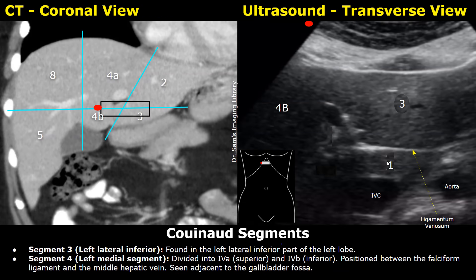This is a coronal CT image showing the interior aspect of the liver. Segments 2 and 3 are in the left lobe. Segment 4 is divided into 4a superior and 4b inferior — it is the middle part of the liver, between the falciform ligament and the middle hepatic vein, near the gallbladder fossa. Segments 4a and 2 are touching the diaphragm, and segment 4b is in contact with the gallbladder.